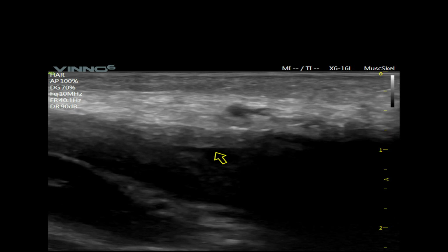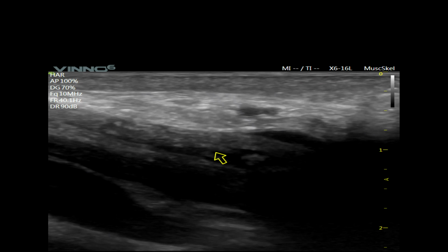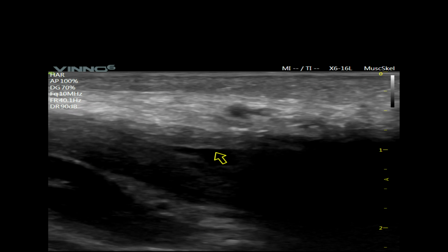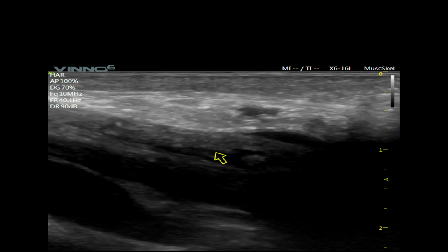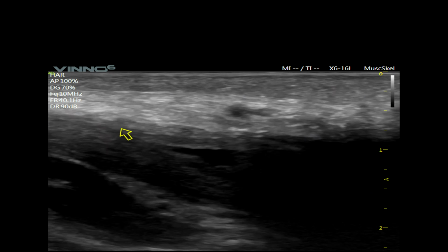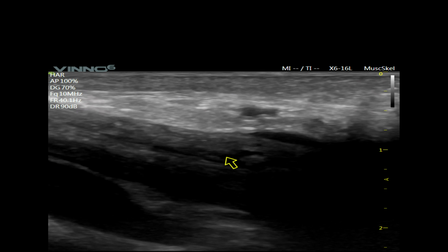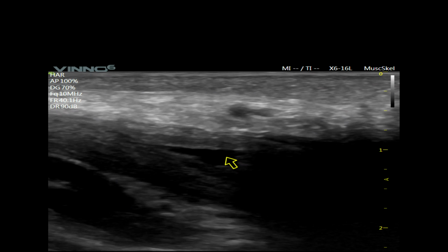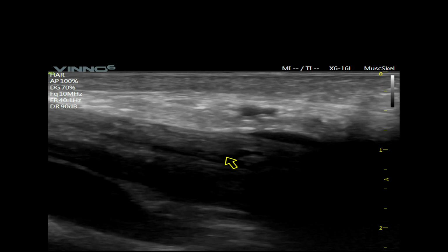It's a longitudinal tear of the flexor unit at the level of the metacarpal. This is actually the ring finger, so it's at the level of the base of the fourth metacarpal, with the left side of the screen up here being distal, this side being proximal. And one can certainly see movement through there on the dynamic test. This was taken 4 weeks post-injury.